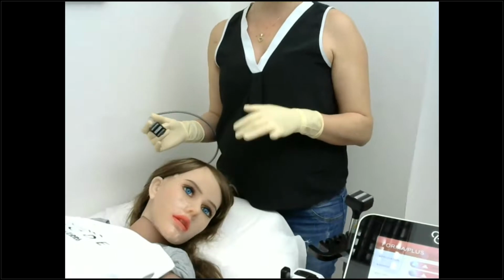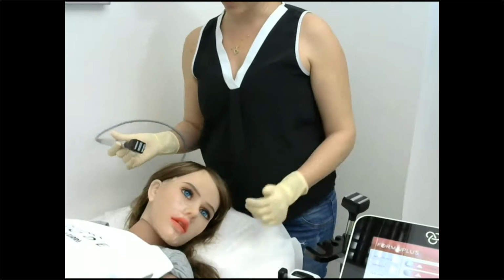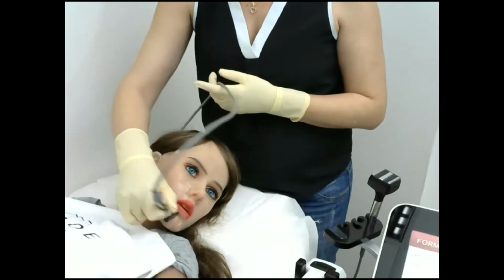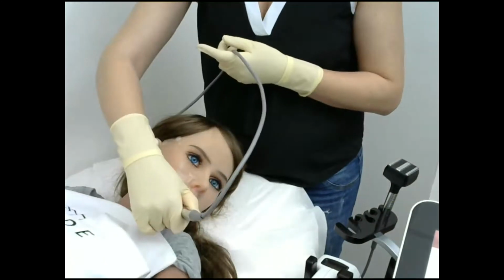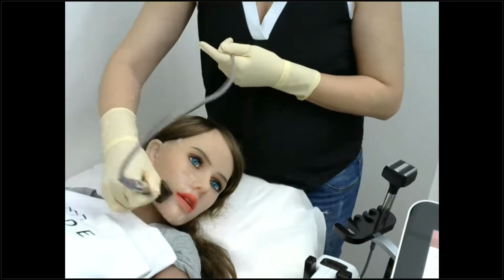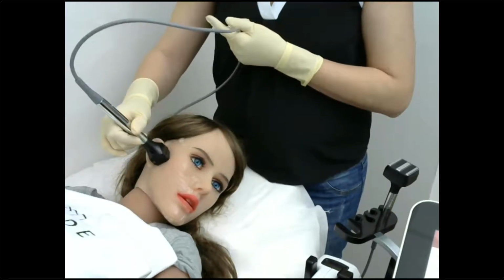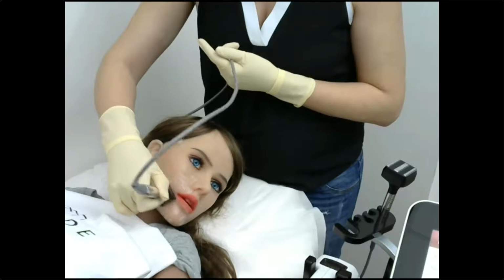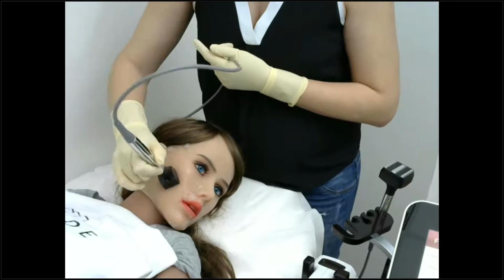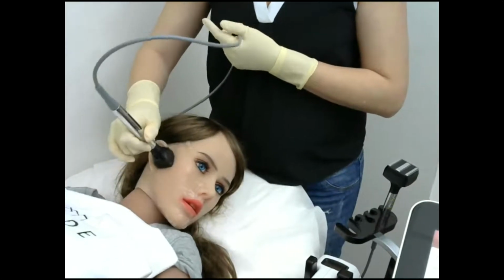Another thing to consider here is a situation in which the patient becomes uncomfortable. In this situation, there are a few things that I do before I change anything on the screen. The first thing I will do is start moving a little bit faster. If my patient complains it's too hot, I want to make sure I press, make sure that I have good contact, and make faster movements over the treatment zone. Second thing I do is enlarge the treatment zone a little bit. If that was my predefined area and the patient complains that it gets too hot, then I would enlarge it slightly. I would take some more skin and make sure that they're feeling okay.